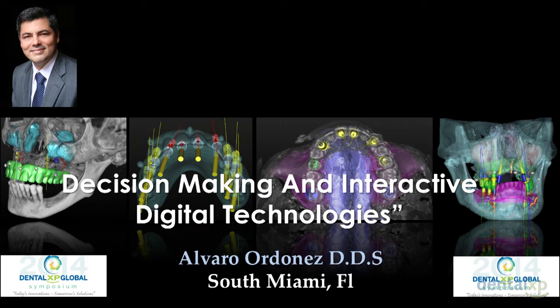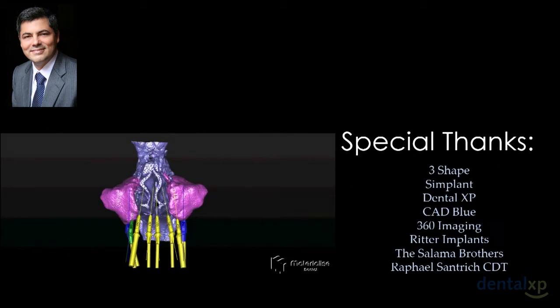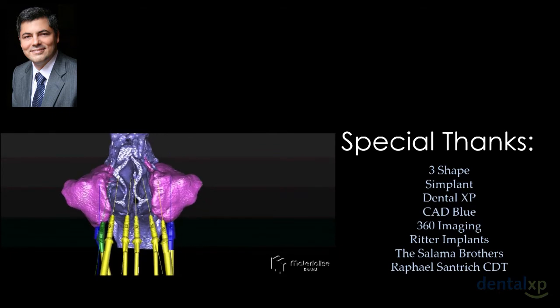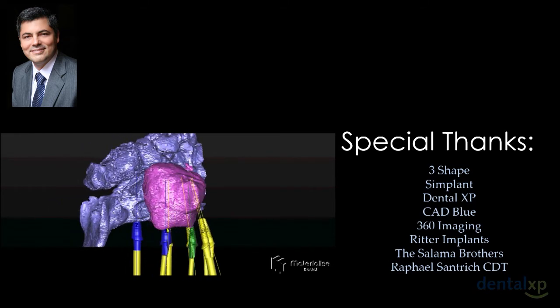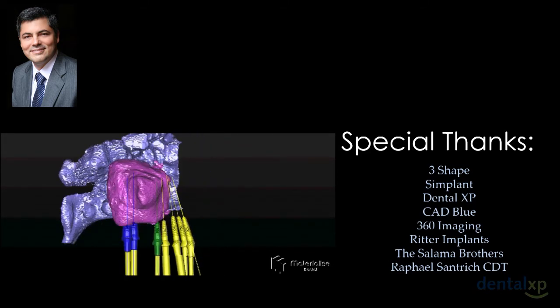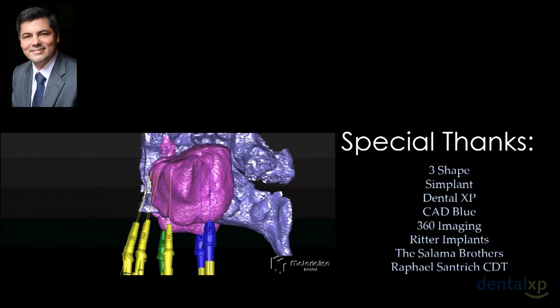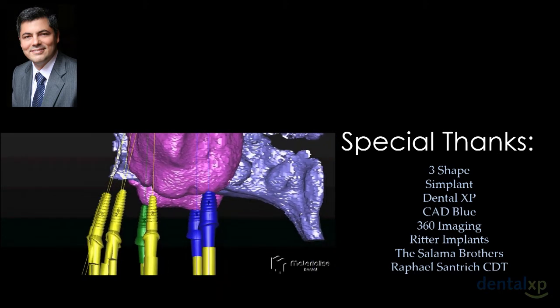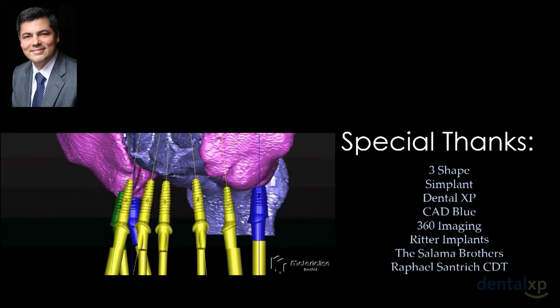Hopefully, if you put a little patience on my English, you're going to take some interesting information home about everything that is going on today related to digital dentistry. My major intention today was not to put together a complicated case, but rather a very simple case, because my message is to understand that digital dentistry is a process of transfer of information, and once you understand how that process of transfer works, you're going to easily implement different techniques in your practices.